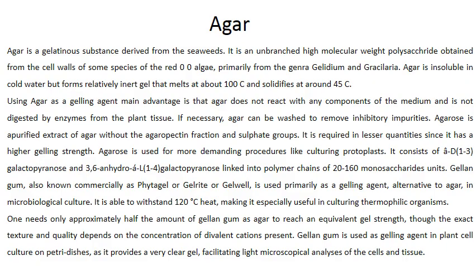Coming to the agar. Agar is nothing but a gelling agent. There are two things we always get confused. One is agar and one is agarose. Agar is a gelling agent that is used in tissue culture, and agarose is again a gelling agent or media that is used in gel electrophoresis, or where marker technology is used.